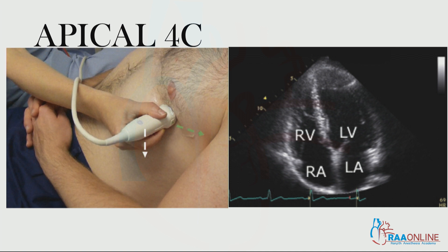Once you place the probe, on the right side of the image you get the left ventricle and the left atrium, and on the left hand side you get the right ventricle and the right atrium. The structures seen are the LA, mitral valve, and LV on one side, and the RV, tricuspid valve, and RA on the other. This view helps identify pathologies of right ventricular function, left ventricular function, and the interventricular septum.